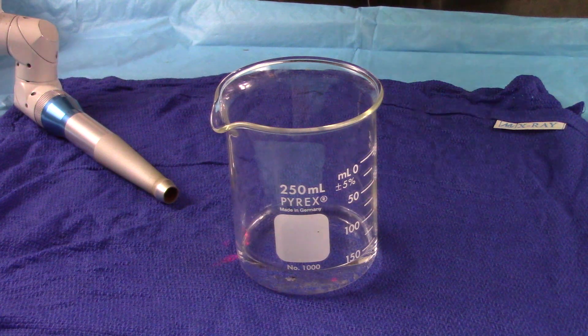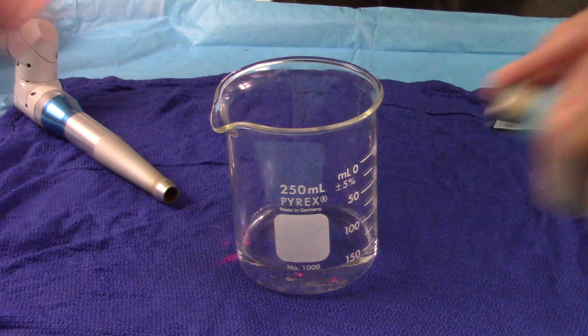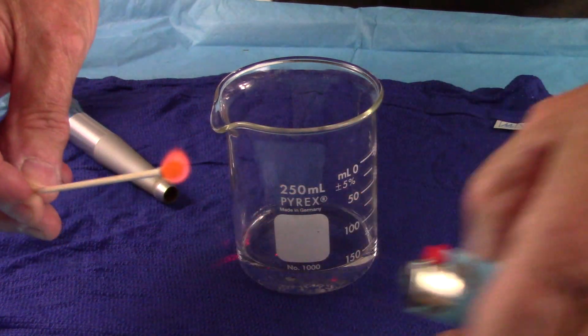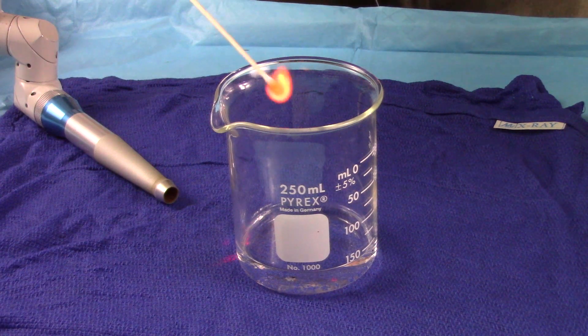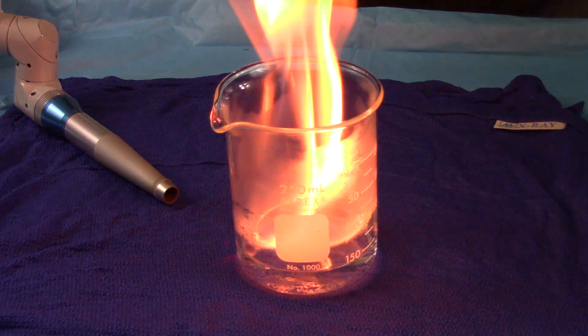I grabbed a lighter and a small swab, and I do not want to get too close with my face over top of this, so let me first light the cotton swab. Now let's see if this is flammable or not. Yep, I think that's quite flammable in there.